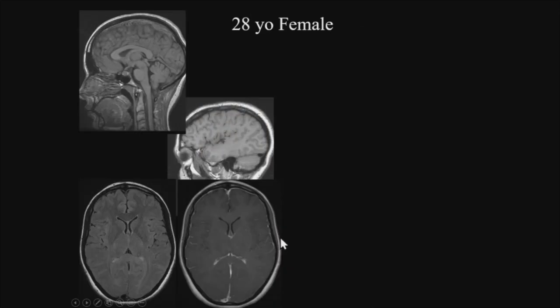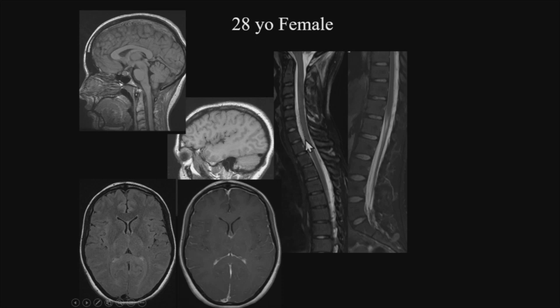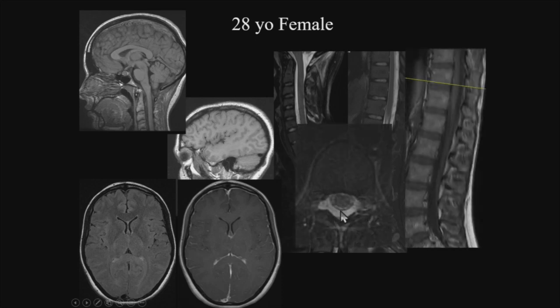Here's another patient, a 28-year-old female who also has positive imaging findings on the brain. In the interest of saving gadolinium, we don't inject these patients with gadolinium anymore. When we do our protocol without gadolinium, we have always found these small areas of dural thickening — pachymeningeal thickening — visible on FLAIR just as well as with gadolinium. Every time we've seen it on FLAIR, we've seen it on contrast and vice versa. This means we can image these patients at night, the scan is faster, there's no injection, and we get head and spine done in one sitting.